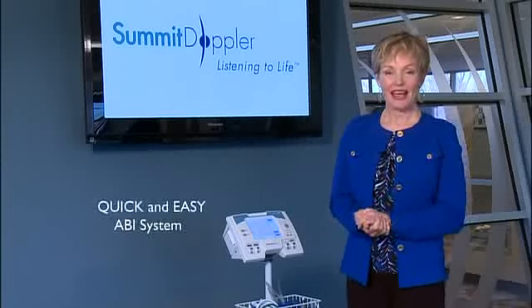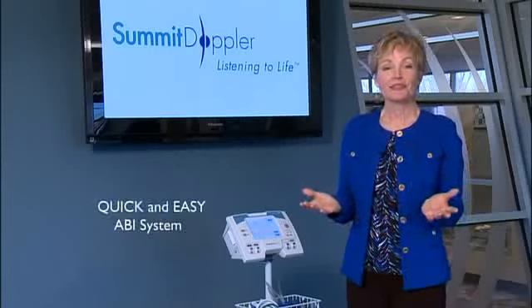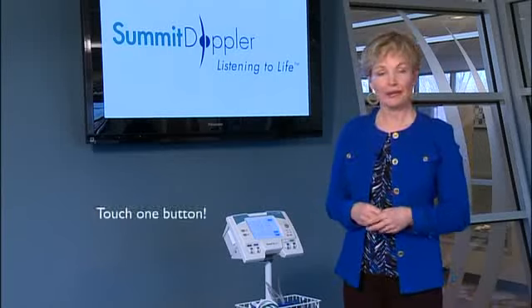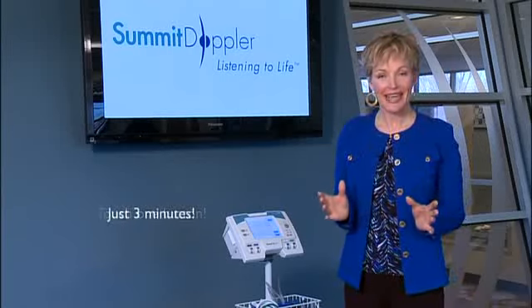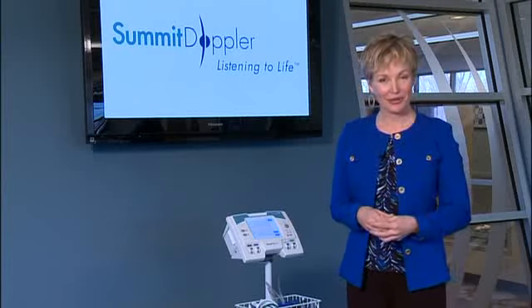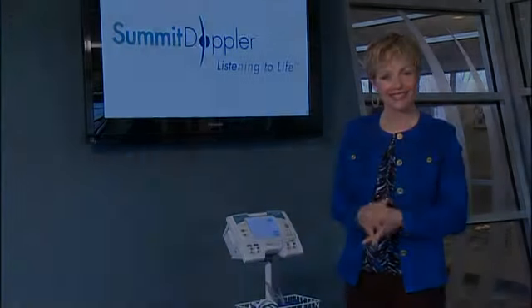The Vantage ABI is so easy to use that after the cuffs are wrapped and the patient rests, with the touch of a button, the entire ABI exam takes just 3 minutes to complete. Now, I know you're anxious to learn how to use this new system, so let's get started.